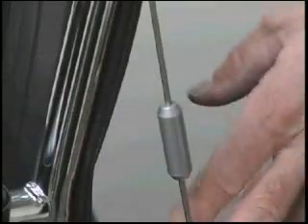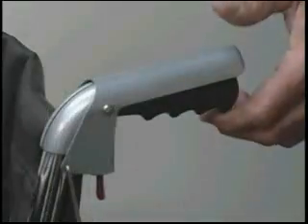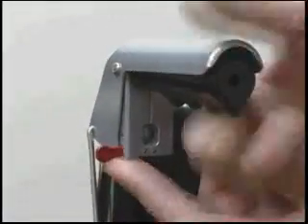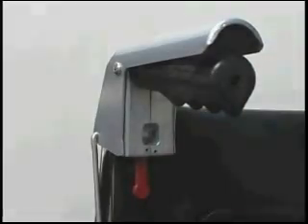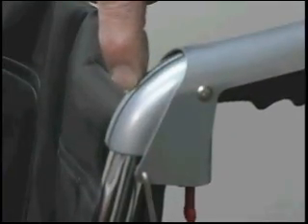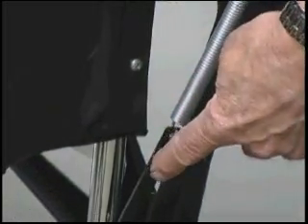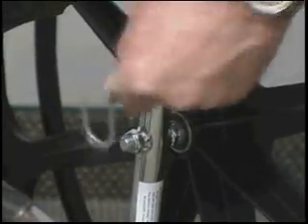Vertical seat strap, brake arm, brake shoe, actuating rod, adjustment for the actuating rod, palm release lever, brake lock off, set and release, mounting block for the palm release lever, tension spring adjustment strap, tension spring anchor hook.